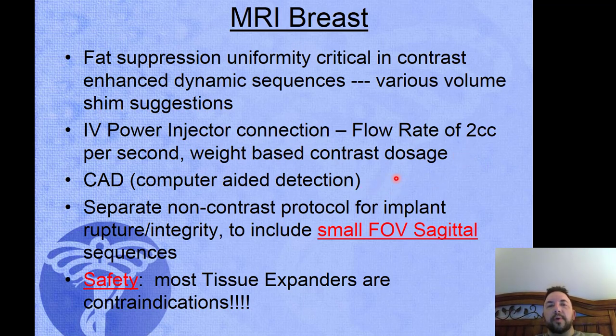One last note I meant to put in the slide. Please do not exceed a 512 matrix so that the CAD systems are able to perform their functionality. Very often, most commonly, the errors that occur with a CAD that's unable to process is because the reconstruction matrix has exceeded a 512 matrix number.